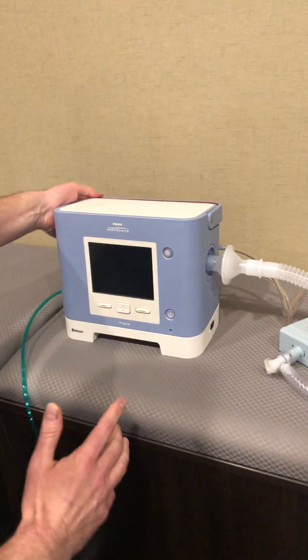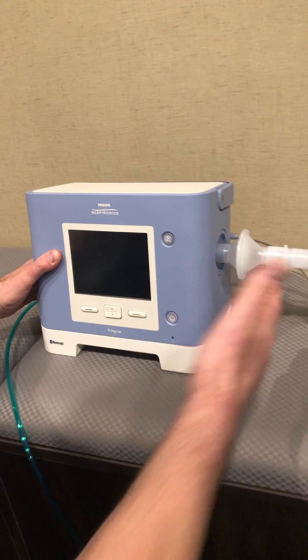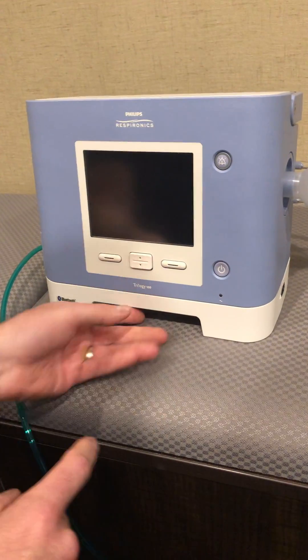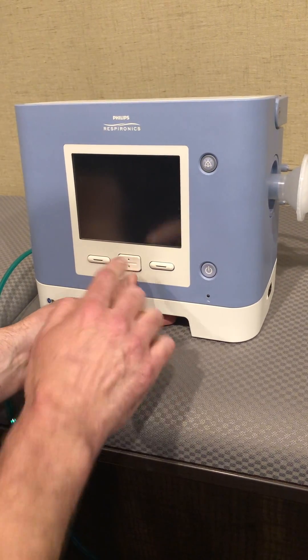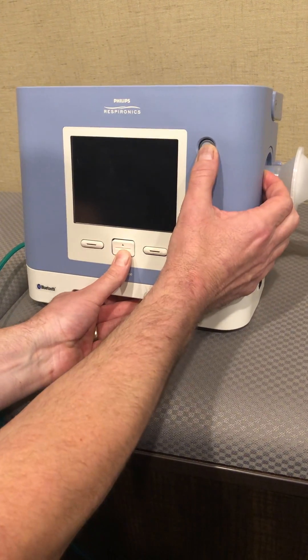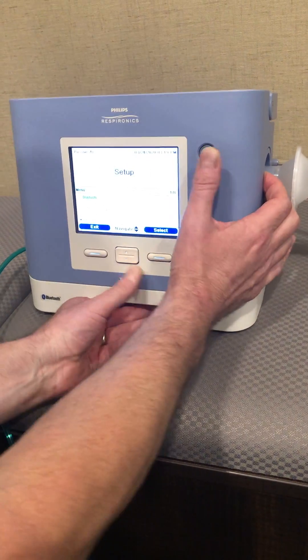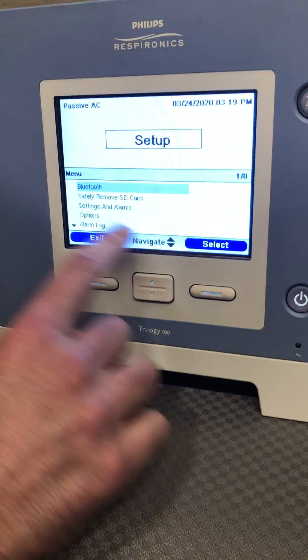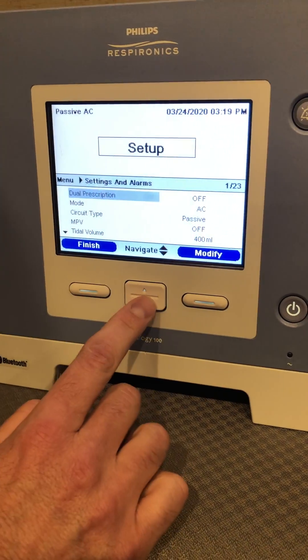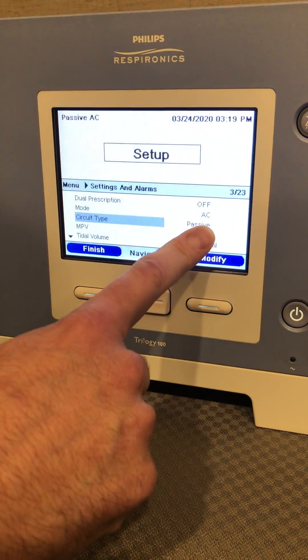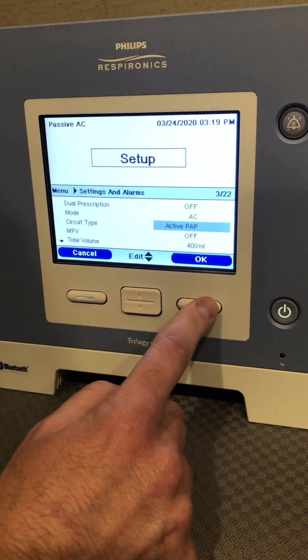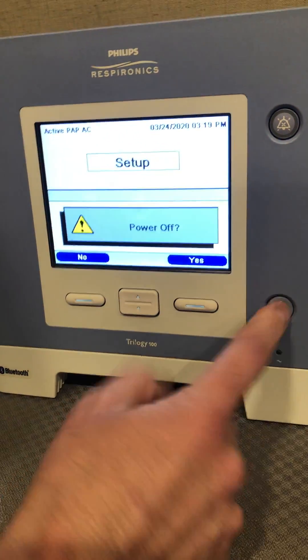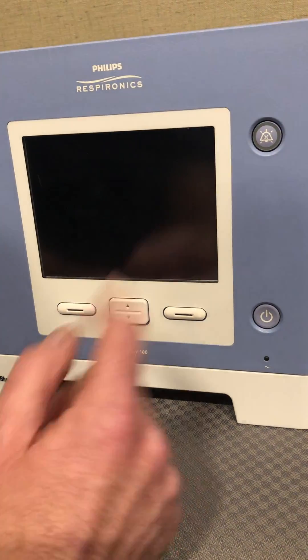The first thing I want to do is make sure that the Trilogy knows I'm using an active circuit. To do that, hold your silent button down with your down toggle at the same time. Scroll down to Settings and Alarms, hit Select, go to Circuit Type — you'll see it currently shows passive. We need to change passive to active, then hit OK. From here we can turn it off and back on.